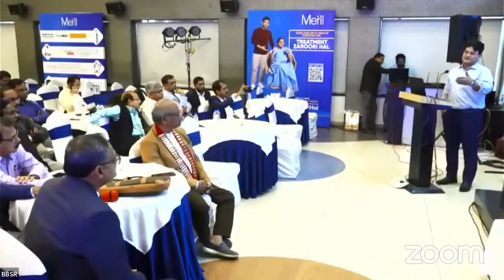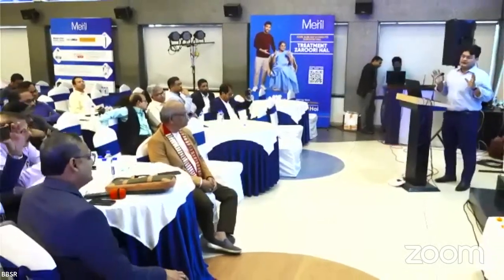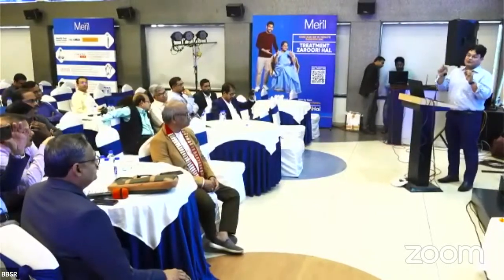Actually, we have to take care so that the robotic arm doesn't come and hit the pins, because the pins again have tracker bulbs. Yeah, as you will see, it has got tracker bulbs. So we have to keep that in mind. You can put pins anywhere, in any way you want, because all the measurements and everything are based on relative motion.